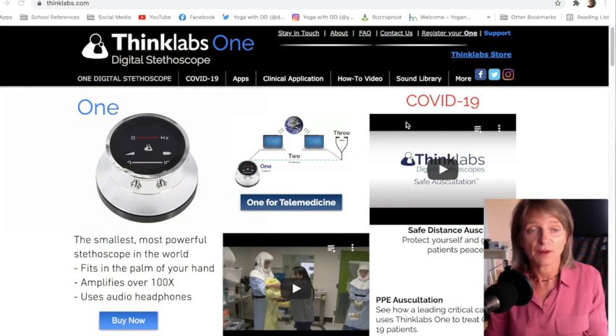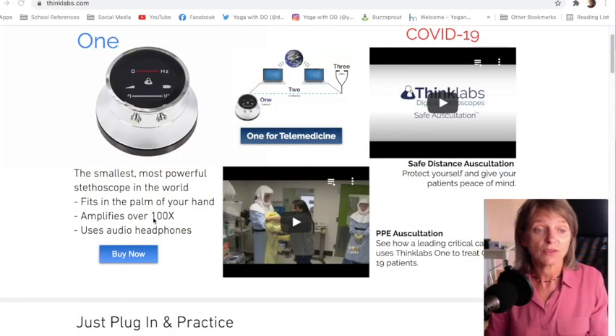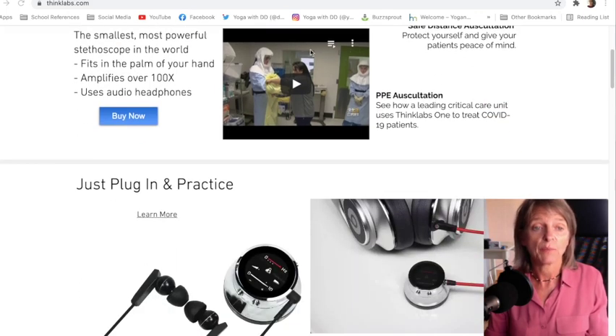We're at the computer. This is the Thinx Labs One digital stethoscope website. On the left side you can see the picture of the stethoscope itself — it's pretty nice looking. Underneath that, you can see that it's the smallest, most powerful stethoscope in the world. It fits in the palm of your hand, as I'll demonstrate. It amplifies over a hundred times and uses audio headphones. You can do telemedicine with it and use it at a safe distance for auscultation, especially wearing full PPE.